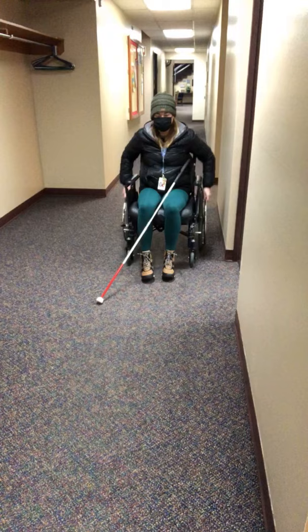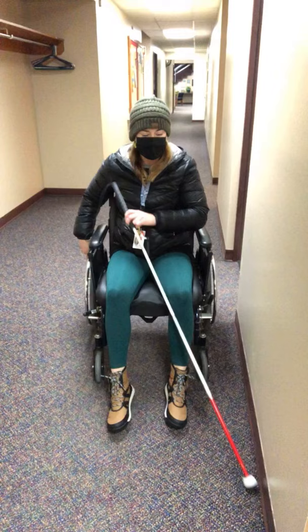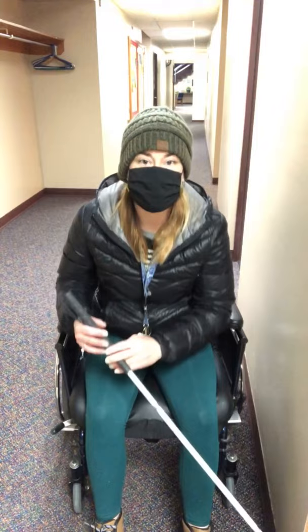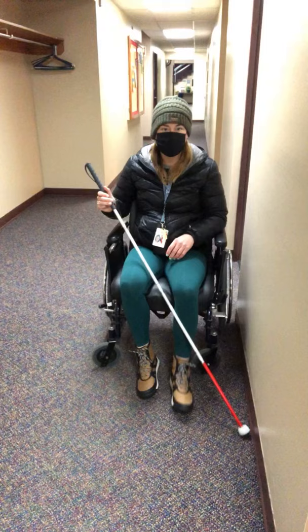Another thing is that maybe they're looking for a turn in the hallway, and so you can actually help them position their cane. 'Let's see what the cane can find.' And then when they feel the end of the hall, the cane is going to push that direction. And you can say, 'Cane found the turn in the hallway. Let's turn right,' or whatever it may be. And again, this is a modified grip, but the traveler is still getting the vibration through the cane.